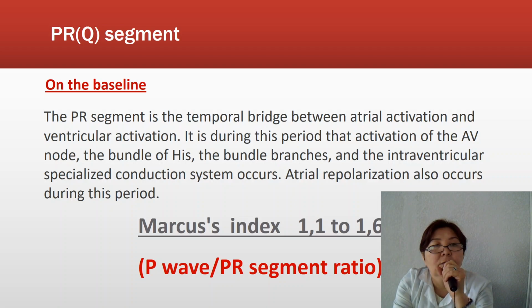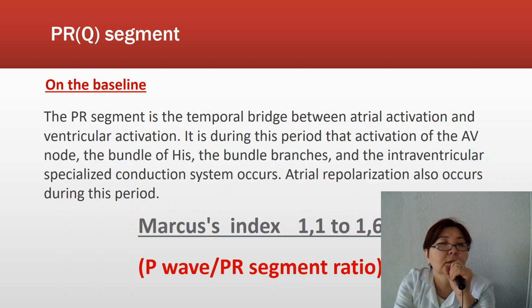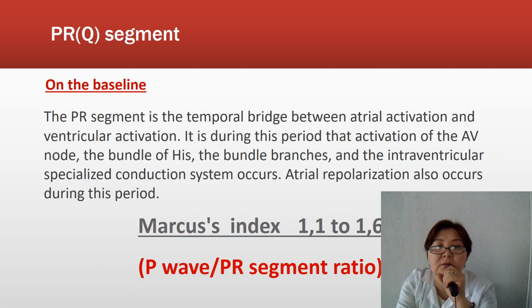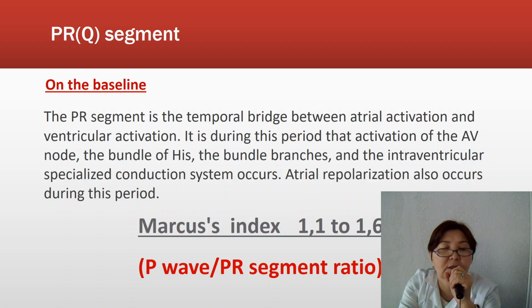PR or PQ segment. It's on the baseline. The PR segment is the temporal bridge between atrial activation and ventricular activation.